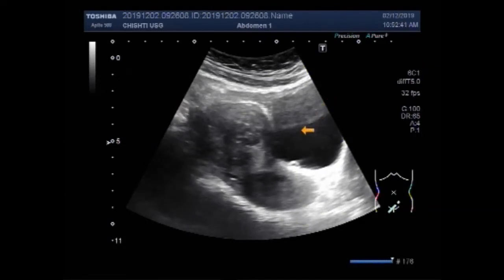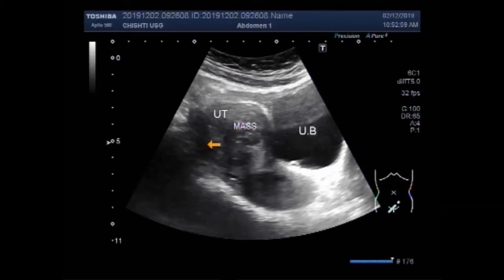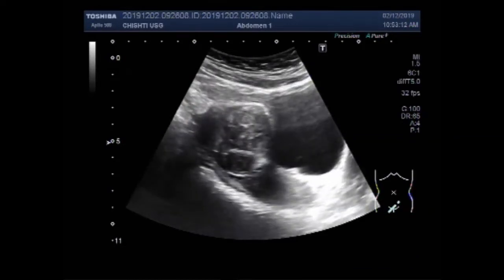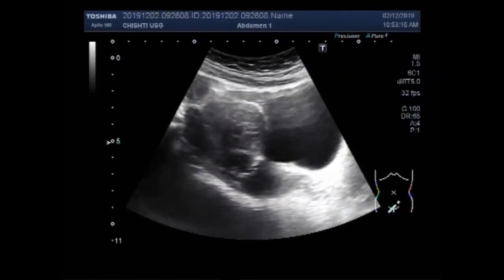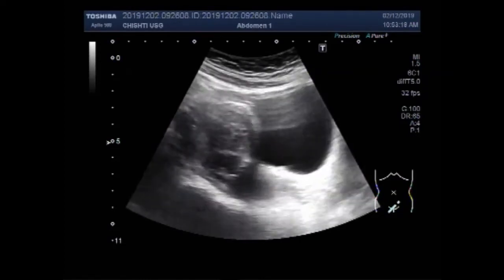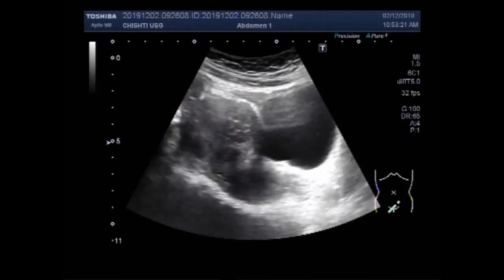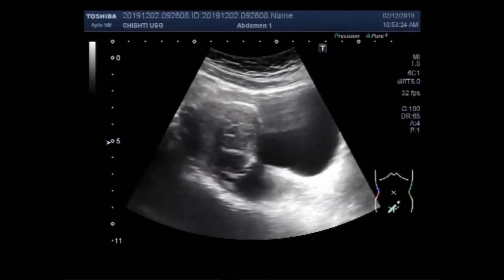In the same patient, you can see the bladder, the uterus, and uterine masses — fibroids. This one is also a mass, and this is another mass. There are multiple fibroids in the middle and distal portion of the uterus.